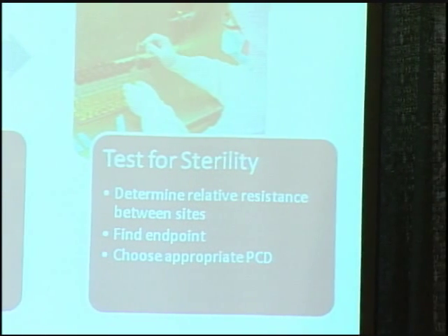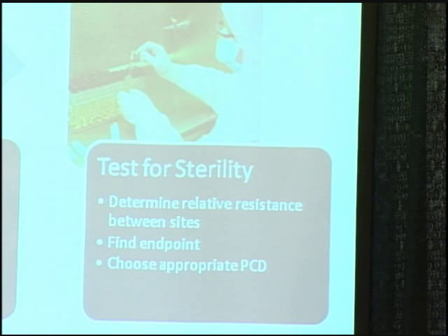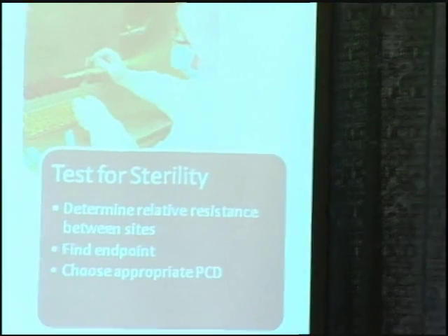You've inoculated those products in all those locations. You're going to pull those, whether they're spore strips or surgical suture that's inoculated with spores, or maybe you had to inoculate the device directly. You're going to take all those locations out, test them in microbiological media, and incubate those for 7 days. And you're just looking for growth or no growth.